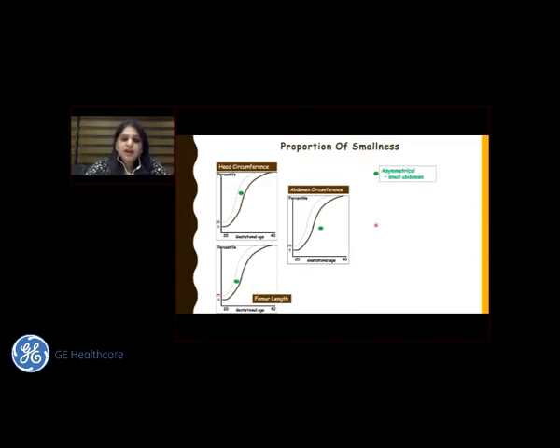So, although we are now done with words such as symmetrical and asymmetrical fetal growth restriction, they are still being reported in a lot of reports, and we need to understand what they actually mean, because they could indicate different underlying pathologies. Asymmetrical means the head is normal, the femur length is normal, but it is the abdominal circumference that's lying less than the 5th centile.